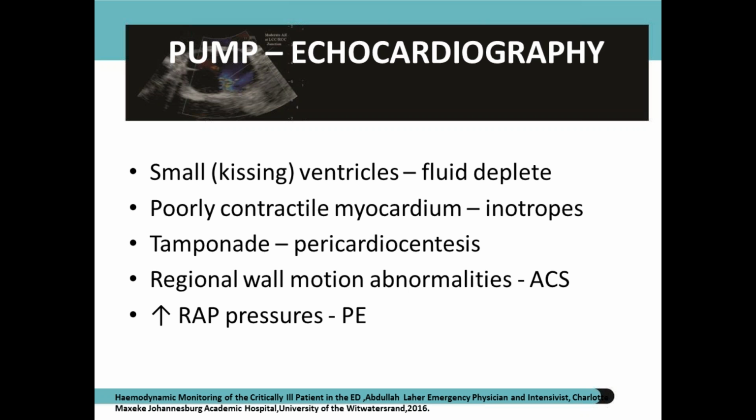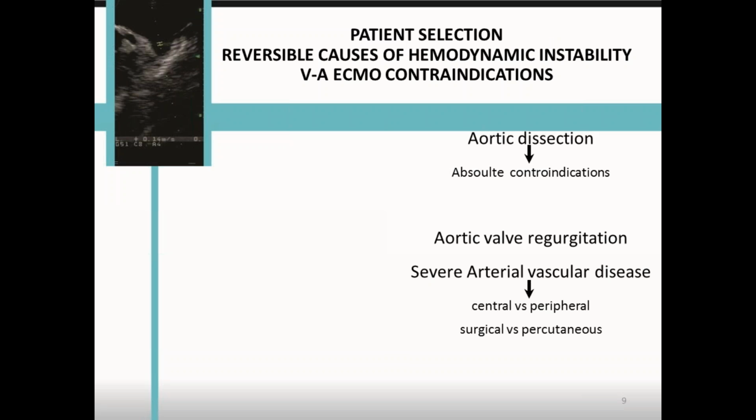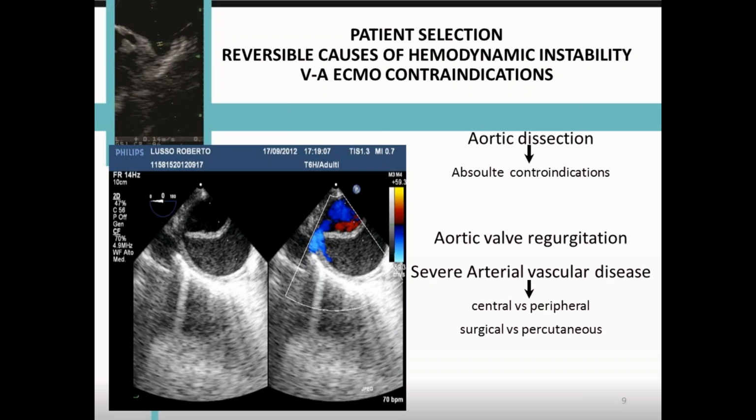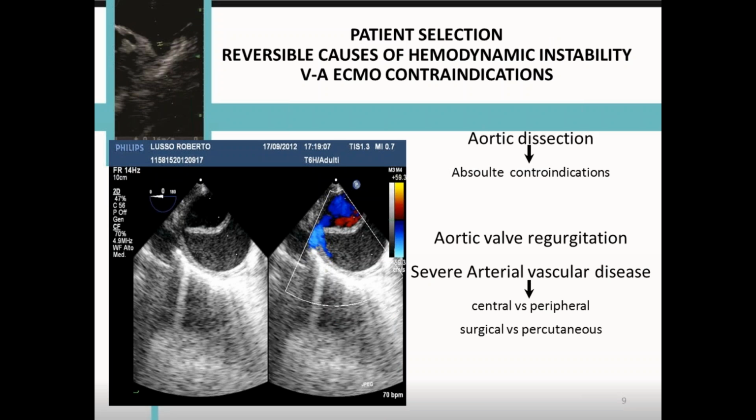So this is how echo helps. While you are choosing your patients, echo is very important. Every patient does not deserve ECMO. You must rule it out. Rule out aortic dissection.